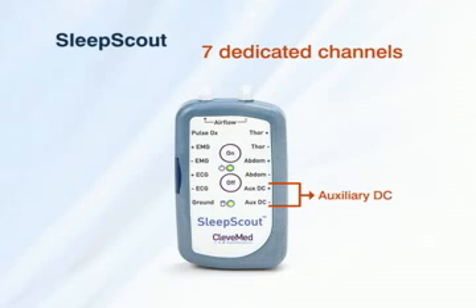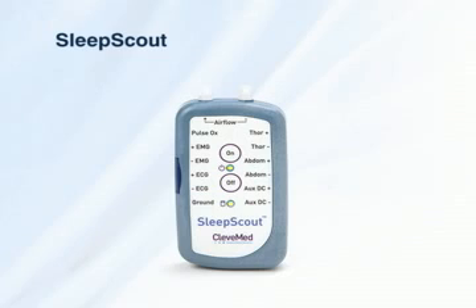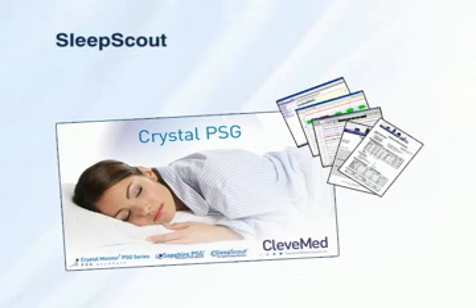Additional inputs include blood pressure, etc. And two additional channels that vary based on the model you choose, including ECG and EMG, or EEG and ECG. In addition to innovative wireless hardware, Sleep Scout includes Crystal PSG, a complete software package for managing patient data.